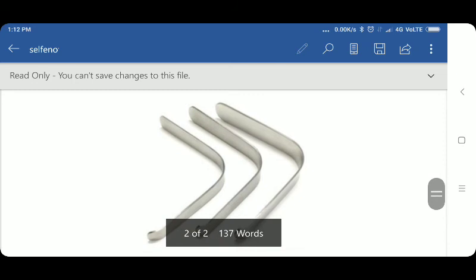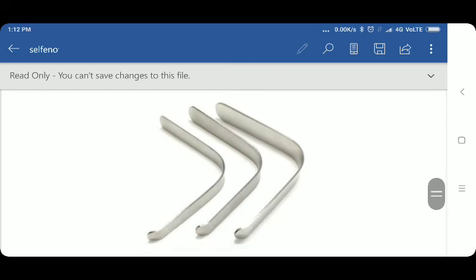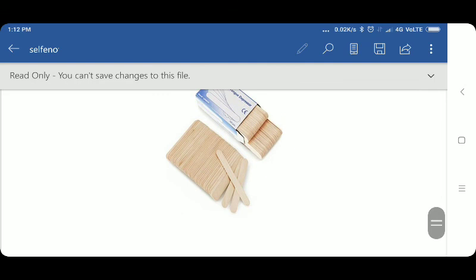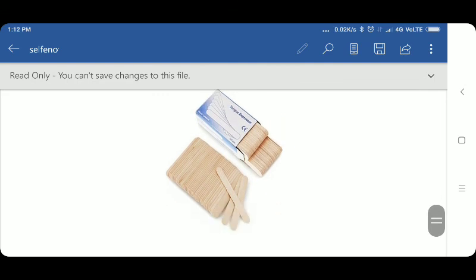Now in this diagram, we can see the tongue depressor which is made of metal. Nowadays, the use of this metal tongue depressor has decreased, and this is the latest use-and-throw type of tongue depressor which is used nowadays.